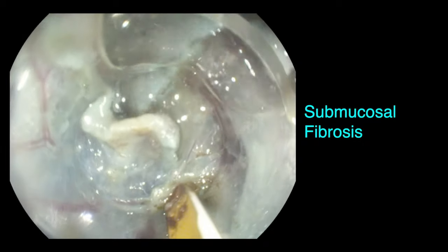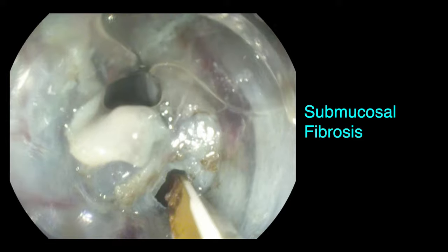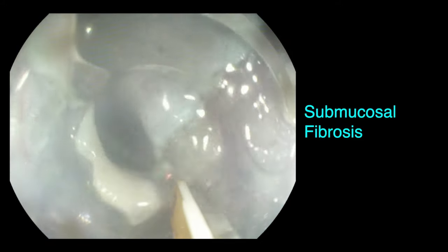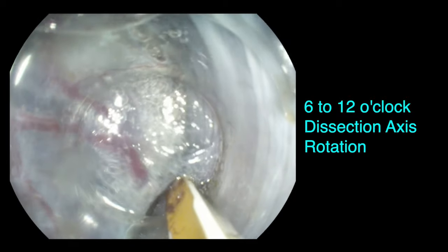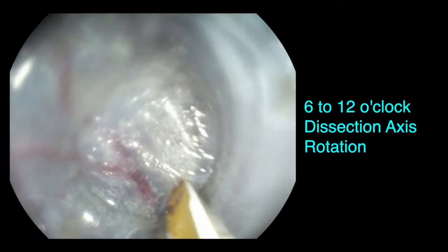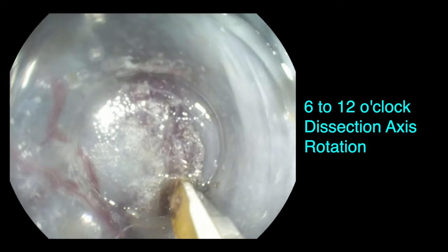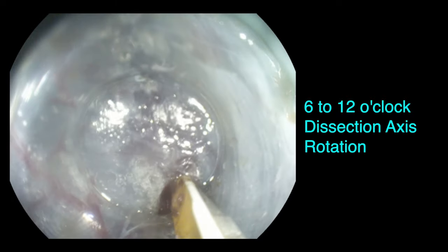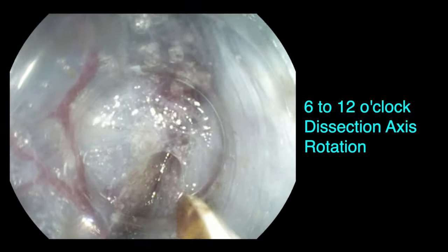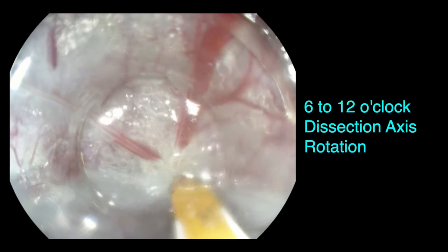Fibrotic patches that have been met, then the device can be used very safely by using only the tip or the convex part of the device, and used in different directions in a multi-directional way, similar to some surgical tools. As you can see here, the device can be turned one-to-one rotation by following the bowel contour and the muscle layer without damaging any muscle bed.